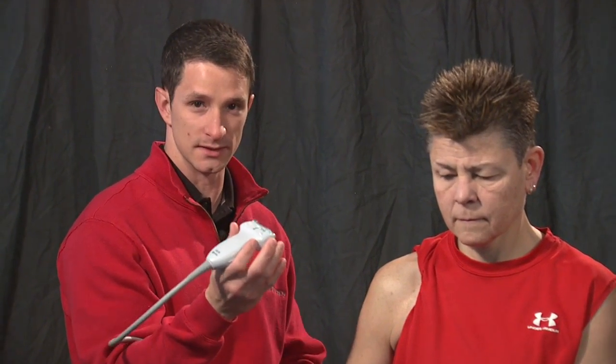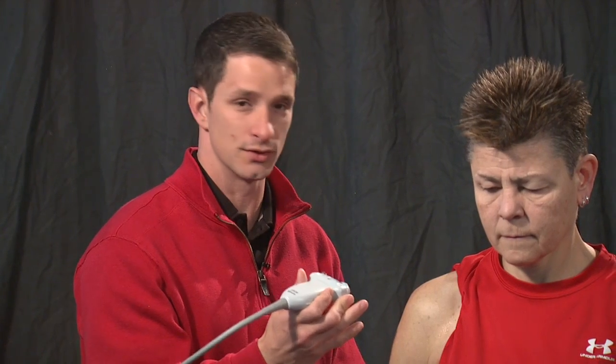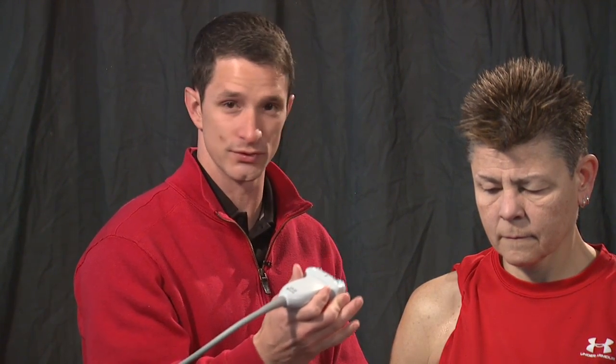Hi, I'm Lane Bailey with ProAxis Therapy, and today we're going to go over the shoulder exam. You want to start off by first holding and orienting the probe in the proper alignment so that you get consistent images and that your exam is consistent every time. You want to make sure that the dot that corresponds to the left side of the screen is always oriented superiorly and medially towards the patient. You also want to grip the probe at the distal end and have at least one or two fingers contacting the patient to ensure optimal contact and optimal surface area.